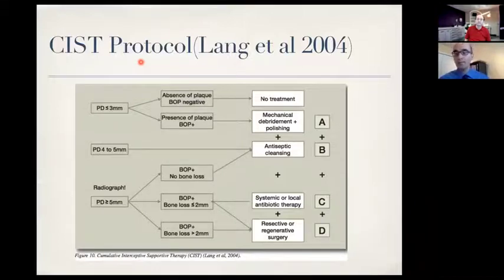And we have to look at the patient's mouth, because sometimes implants may not be distinguishable from natural teeth. So we want to check our records and radiographs before we use stainless steel curettes or regular ultrasonic tips. Right. We want to identify which structures are implants and which are natural teeth.